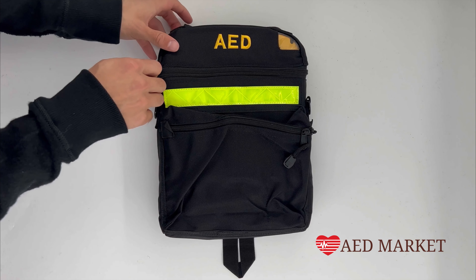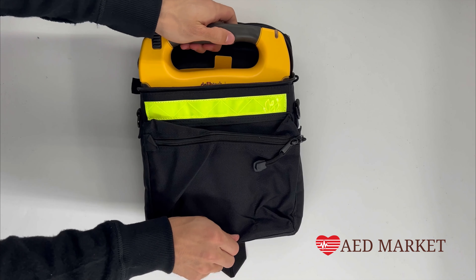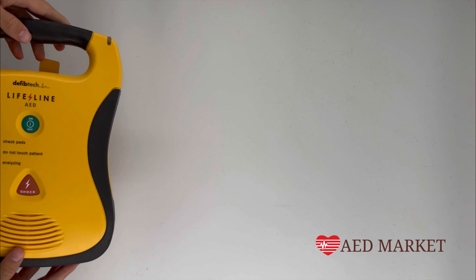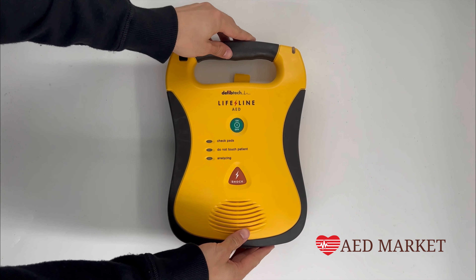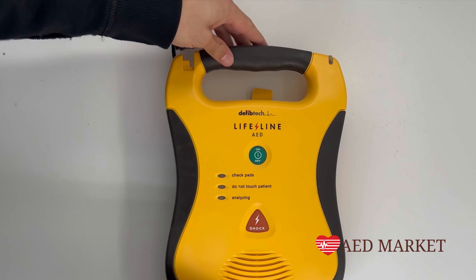To begin, remove the AED from its case. To install or replace the pads, start by unplugging the connector from the top of the device and gently pulling the pads out from the back.